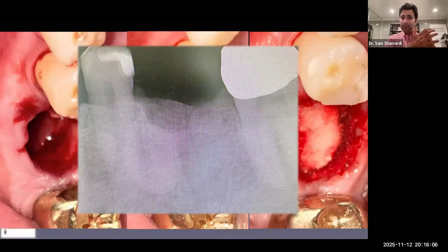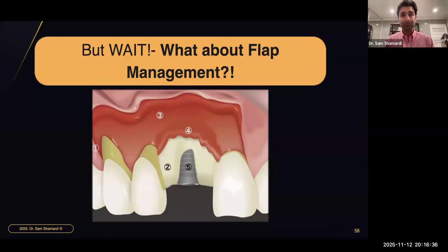We're still going to be waiting those multiple months of time to allow the maturation process to occur, but this just provides us more flexibility in terms of additional options. So more options that are there for you. Again, I really would only look at these types of products in cases where you're either going to be restoring with a bridge and or you're going to provide extensive healing time with no bony wall defects. Otherwise, again, the traditional bone graft with a membrane is still our gold standard way to go. So that gives us another option there.